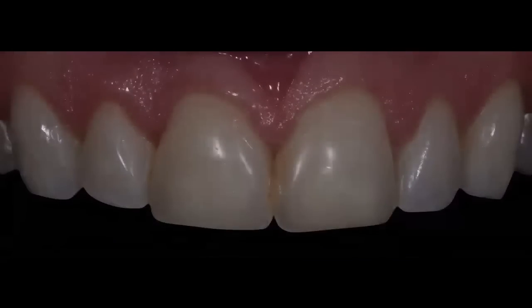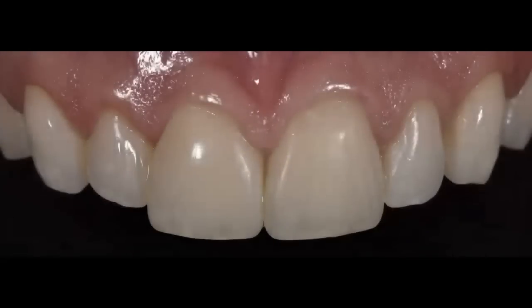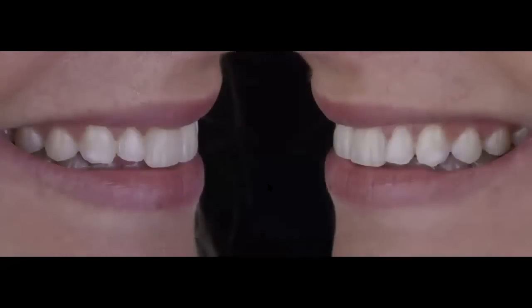And this is how we started the case. And this is 15 days later. You can see the transition between the composite and the tooth structure on the gingival third is very seamless. You can see the high translucent effect that we were able to achieve in the incisal third by combining all these different colors. You can see now how the shade blended in well with the lateral incisors and the canines.